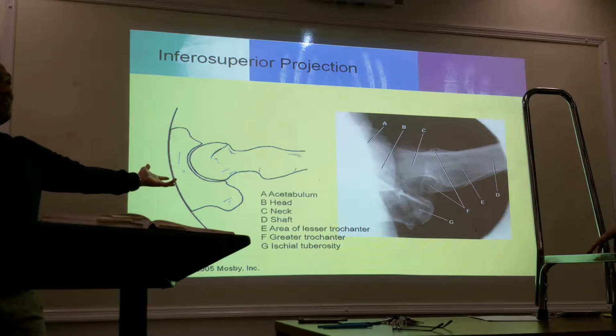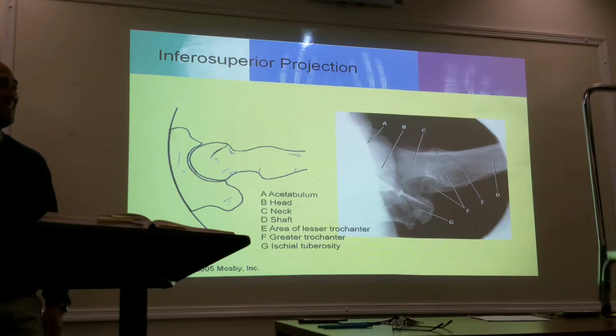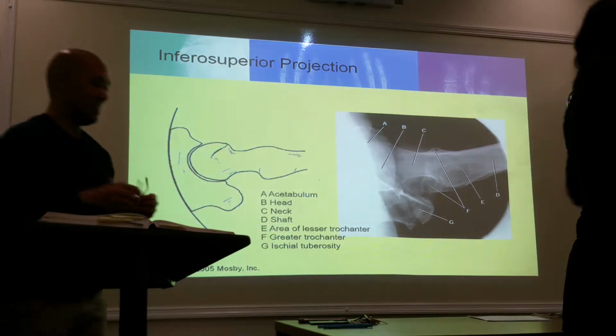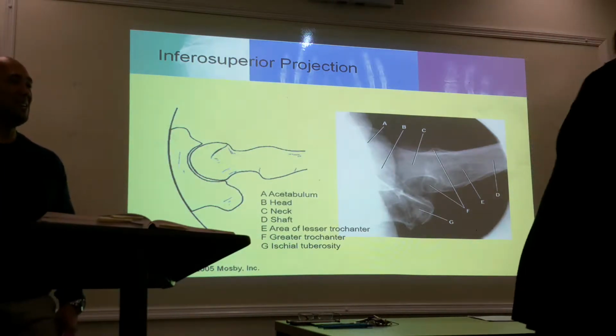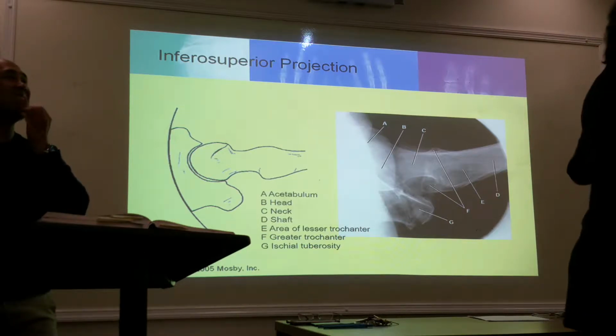Look, this is what you use. No trash can or sponges. This is very secure. So find a stool and put it on the table. The patient lays down and then they just put their foot up on that. If you move it closer, it brings her leg back more. If you move it this way, it brings her leg down and gets it out of the way. It has stoppers on it so it doesn't slide off the table.